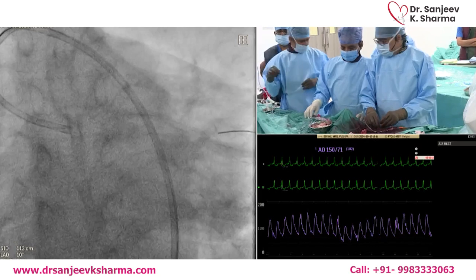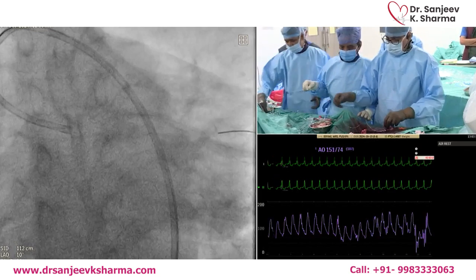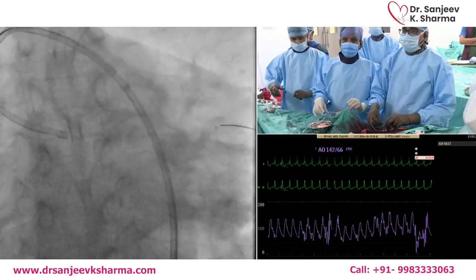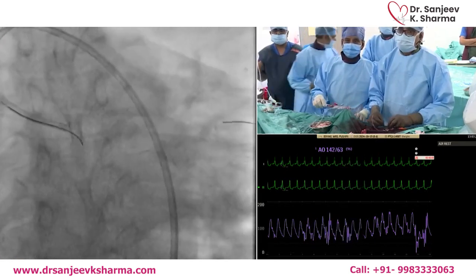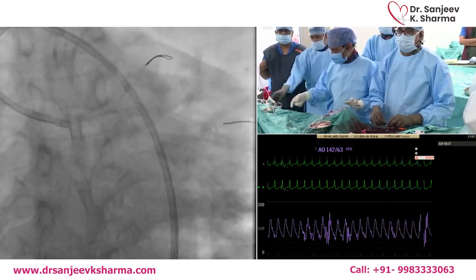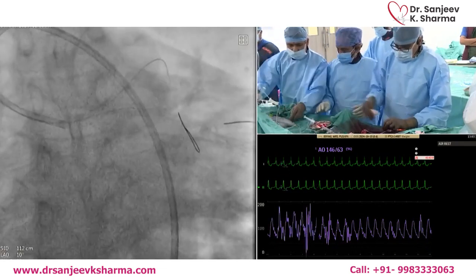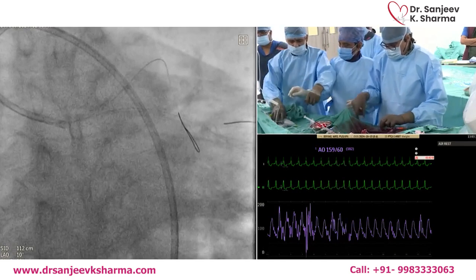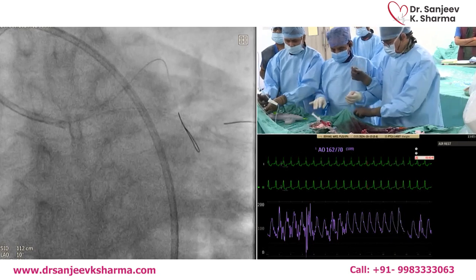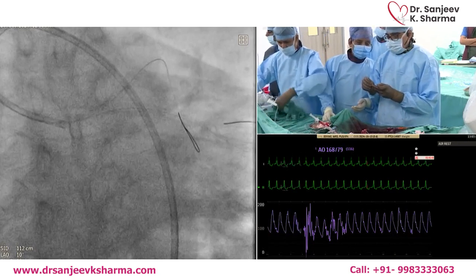Dr. Samin and Dr. Roxana, I think I completely agree. Your concern was hemodynamic collapse during any of the complications we might have during this. Dr. Samin Sharma has huge expertise. But for young people, I think it's better to have an intra-aortic balloon pump, even if their LV is normal, so that if there is some complication, you can at least have something to support. Not Impella, of course. Impella is for when you have a very bad LV. But in this case, an intra-aortic balloon pump should be used by all, unless you are hugely expert like Dr. Sharma with the intra-aortic balloon pump and Impella devices.